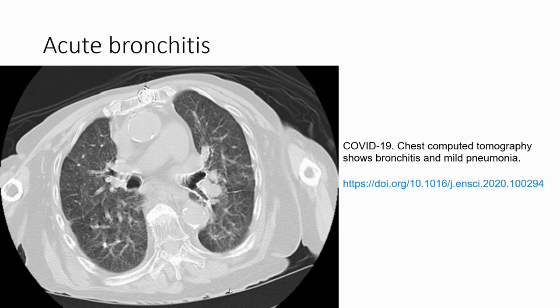On CT, in this case of COVID-19, there is bronchitis and mild pneumonia. We see increased thickening of the primary and secondary bronchi of both lungs, increased attenuation of the wall, and some ground-glass opacity in both lungs.